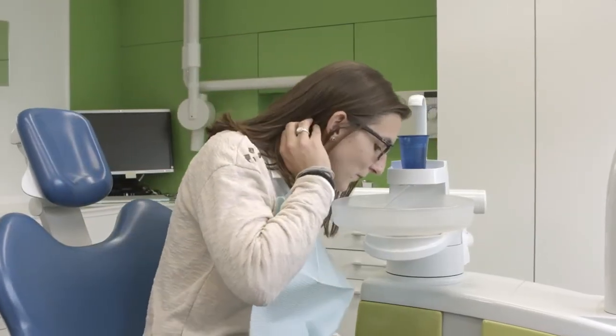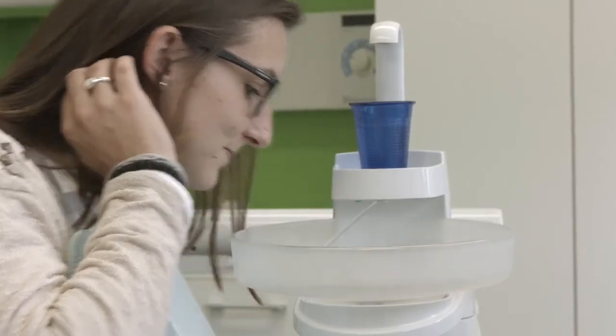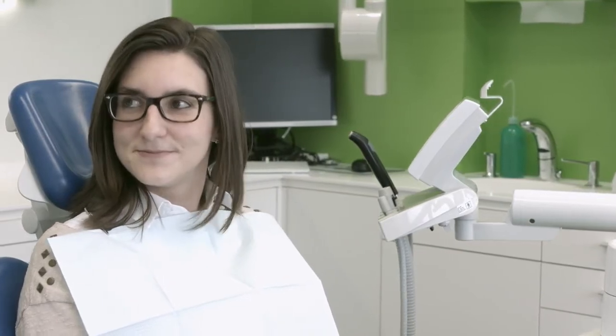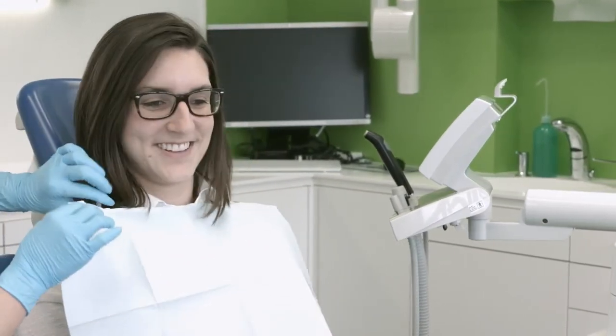Our tip: do not ask your patients to rinse immediately after the application of the fluoride varnish. Only ask them to spit out. Patients should refrain from eating and drinking for one hour. This enables the varnish to take best effect.